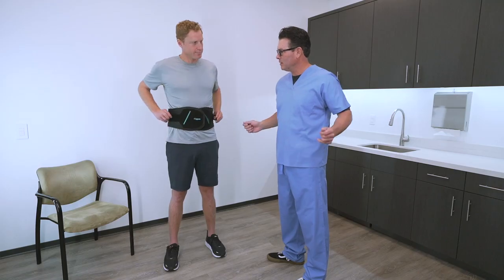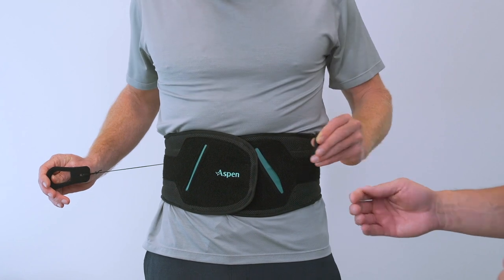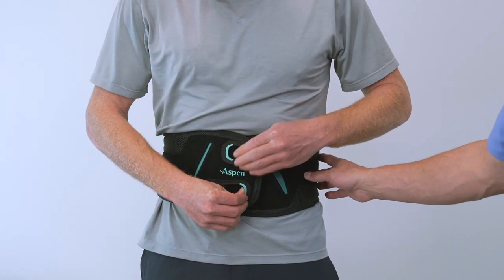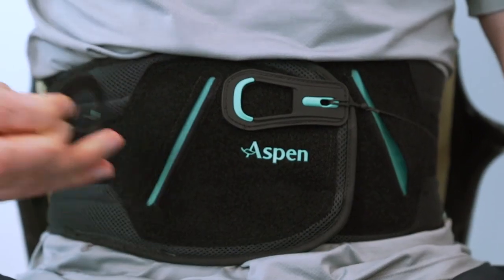Slip each thumb into the pull tabs and extend the tabs out and away from the brace. When desired compression is achieved, place the hook side of the pull tabs down onto the loop material to secure. To maintain effective, comfortable support while sitting, the brace can be loosened by adjusting the pull tabs.